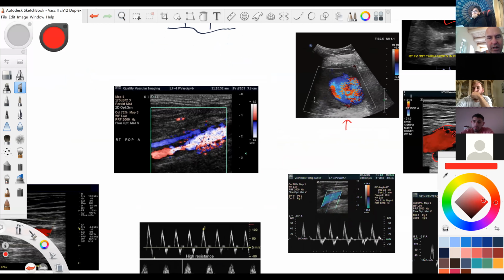This picture is awesome. So you guys can see, most likely, you can see the stenosis right there. So we're starting to get aliasing in there, and the aliasing continues. So that jet is really boring through that artery even after the stenosis. But look what we have here.